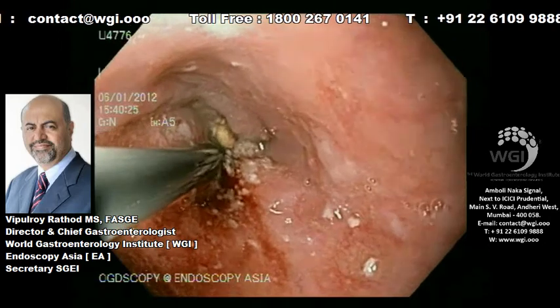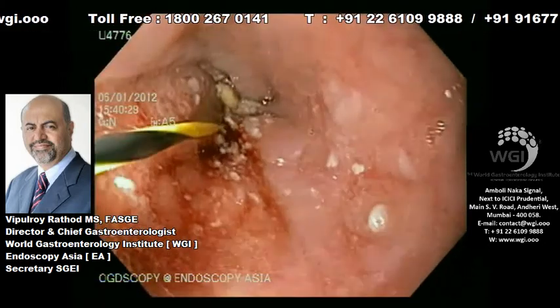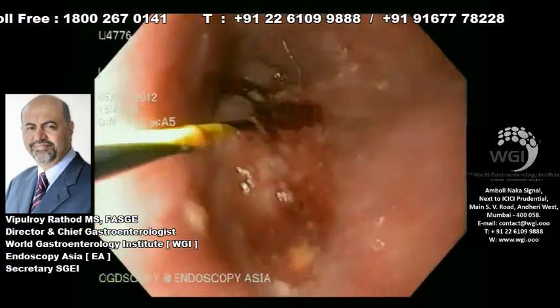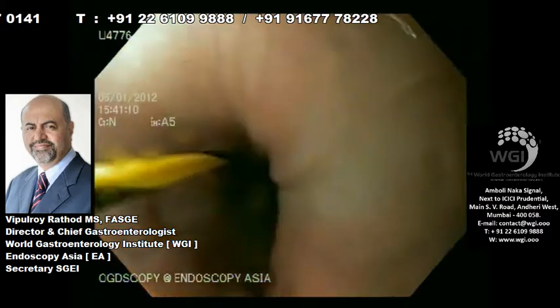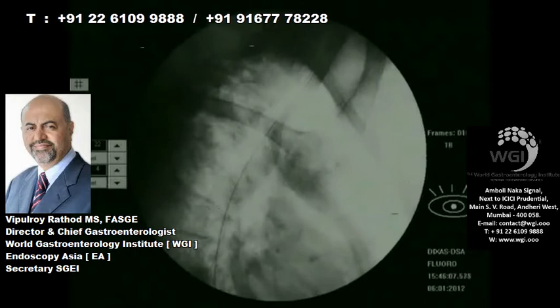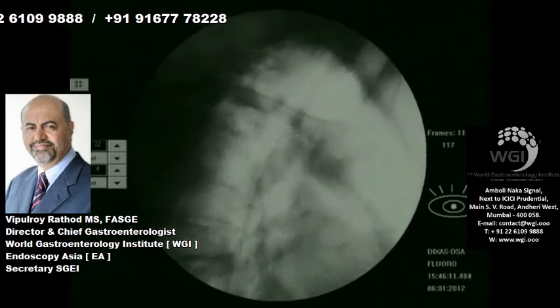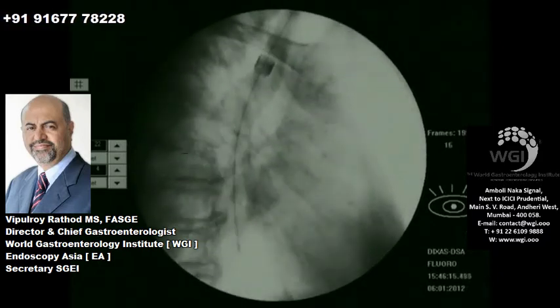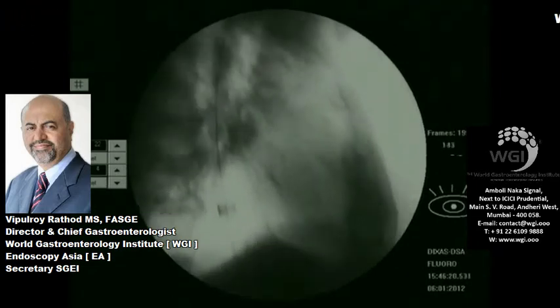The hydrophilic guide wire is now replaced with a stiffer wire because we need to pass some dilators — the Savary-Gillard dilator by Wilson Cook. You can see here the wire is in place. It's an extremely tight sclerotic fibrotic stricture in the upper third of the esophagus. We removed the scope and now we are pushing a 9 mm Savary-Gillard dilator over a guide wire with a radiopaque marker.